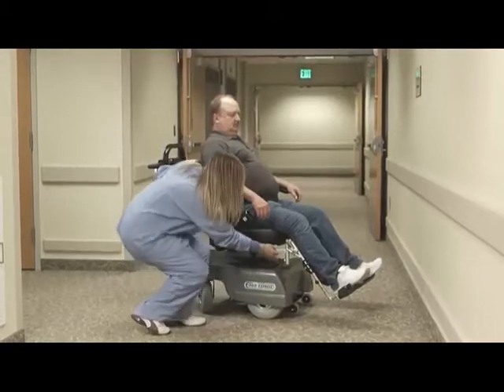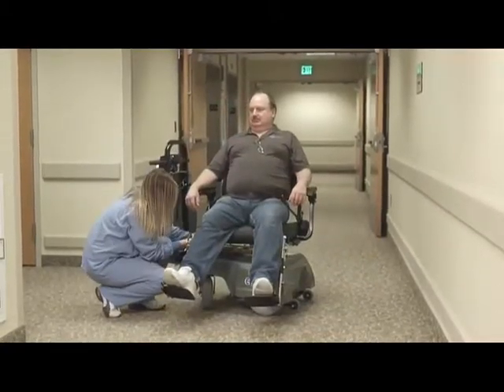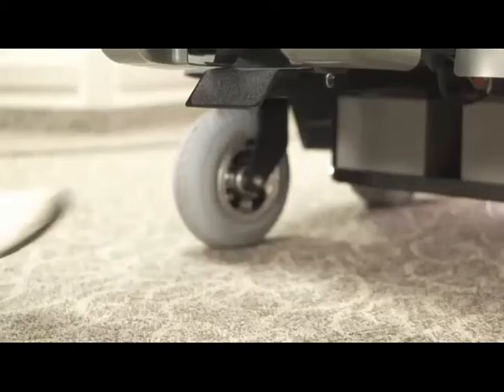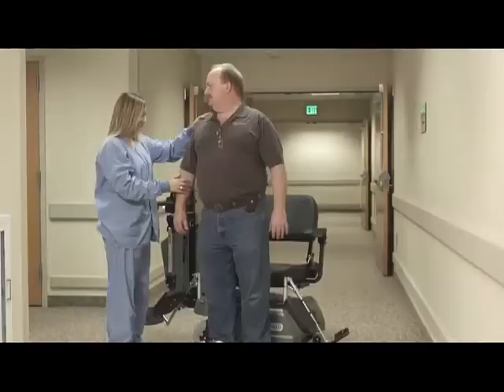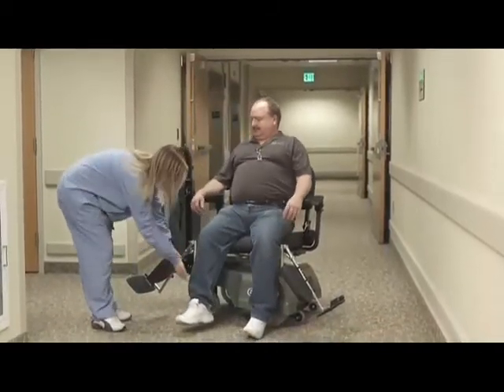Included in the many features of the PTC is the swivel seat for easy access. Before loading or unloading patients, first depress the foot lever, which locks the chair in place. This keeps the chair from rotating while transferring patients in or out of the chair.